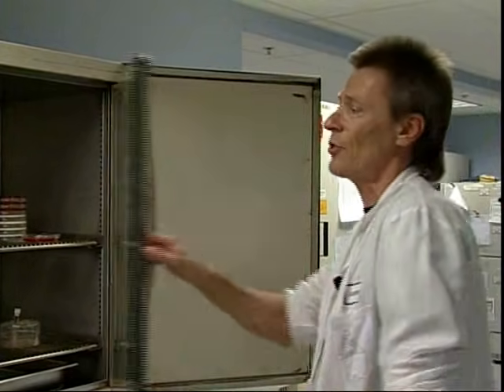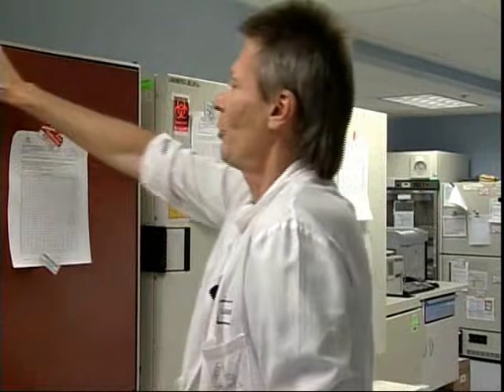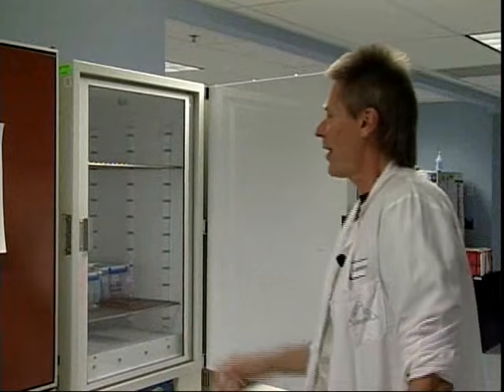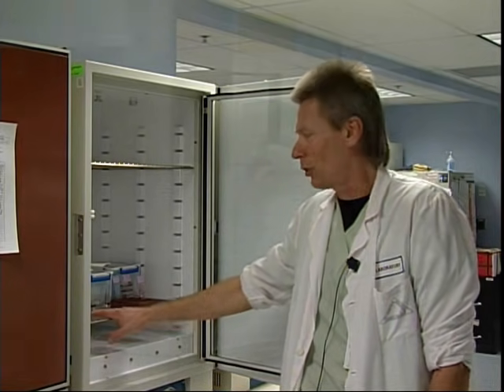There are a few exceptions, though. We do have a 42-degree incubator for a specific organism called Campylobacter. You've probably heard of that. It's an enteric pathogen, and it's grown at 42 degrees because, number one, Campylobacter prefers it a little bit warmer, and also 42 degrees inhibits all the normal flora that would normally be found in the stool.